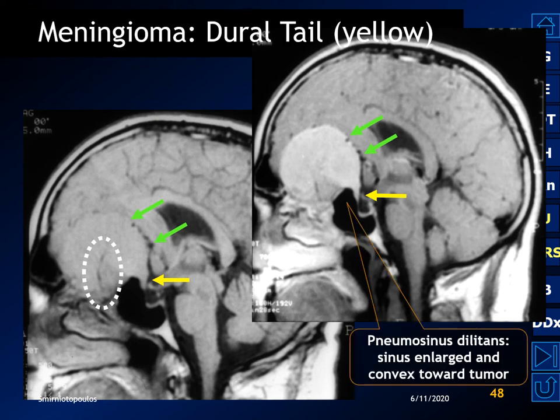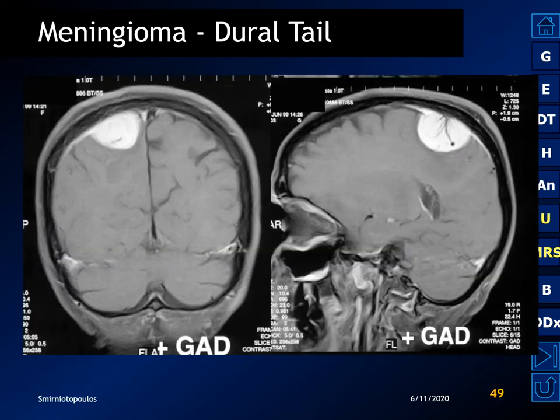Another curious feature observed in meningiomas is called pneumosinus dilatans — an almost paradoxical enlargement of the air-filled sinus convex towards the tumor. Here is another example of a dural tail: this curvilinear thickening coming away from the edge of the hemispheric mass, also demonstrating prominent flow voids within the tumor.